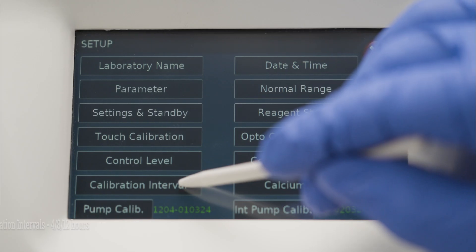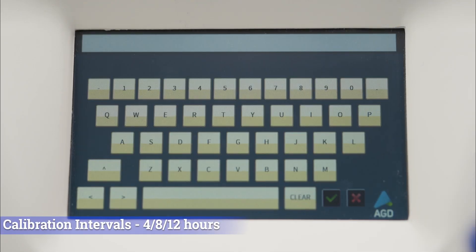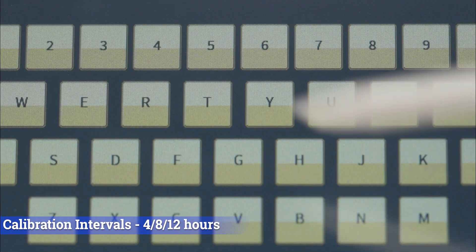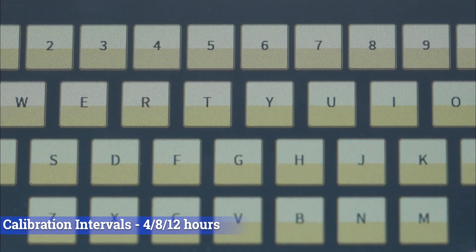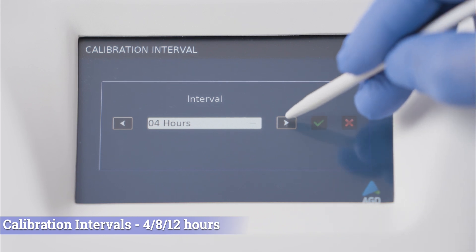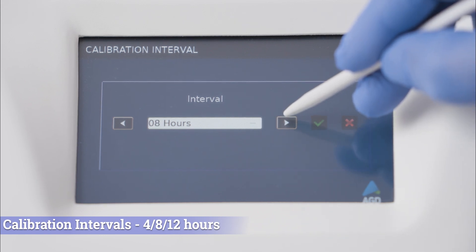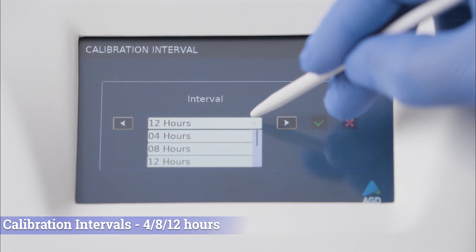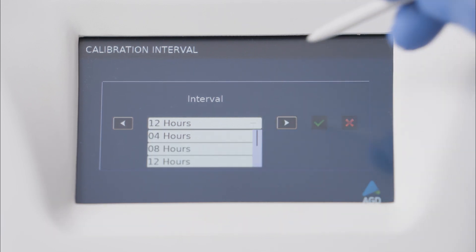With automatic calibration, you can rely on consistent and reliable results without the need for frequent manual adjustments. This not only saves time but also ensures accuracy.